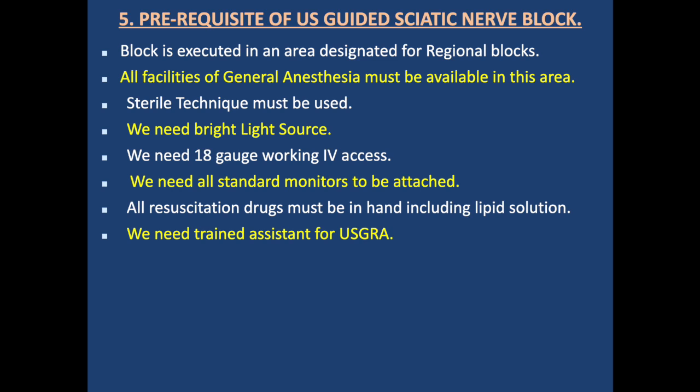We need 18 gauge working IV access. We need all standard monitors attached. All resuscitation drugs must be in hand, including lipid emulsion to manage local anesthetic systemic toxicity. We need a trained assistant for ultrasound guided regional anesthesia.